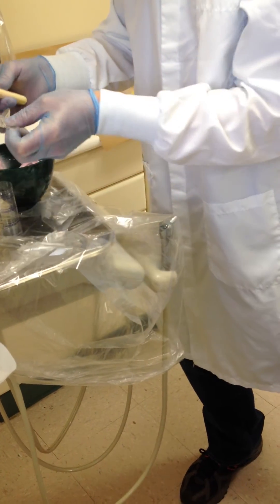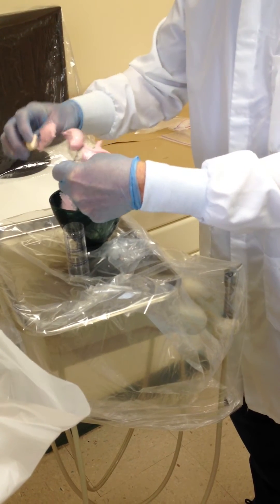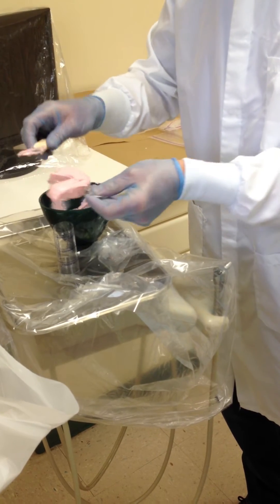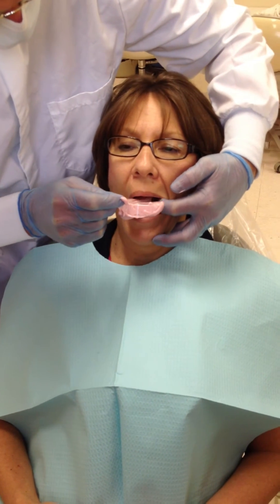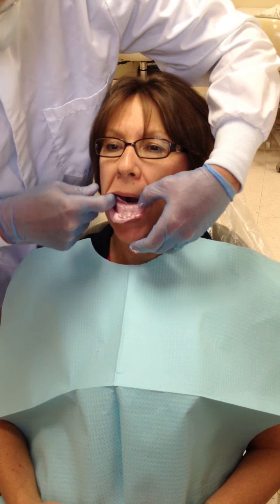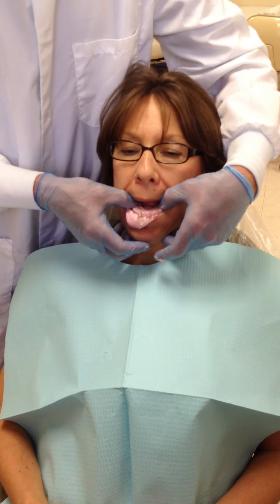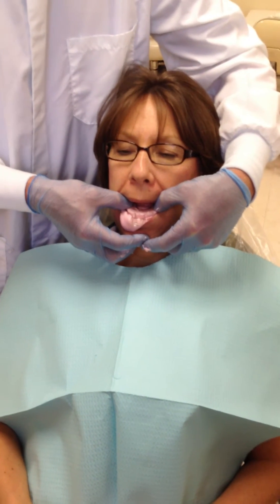We will add the material to our tray. Stepping behind our patient — open please — we will insert the tray. Lift your tongue up please. Good. Head down, and we will just hold here until it sets.